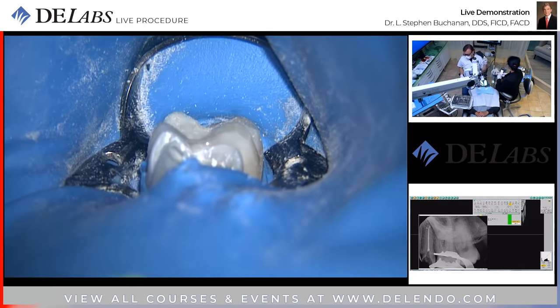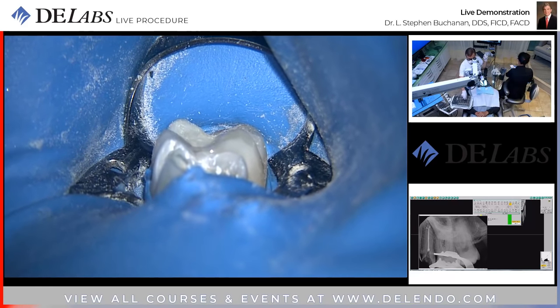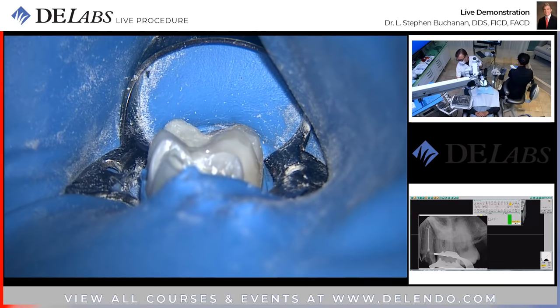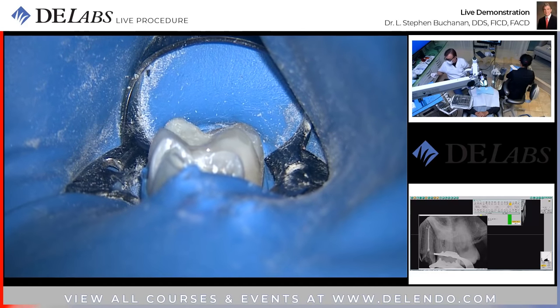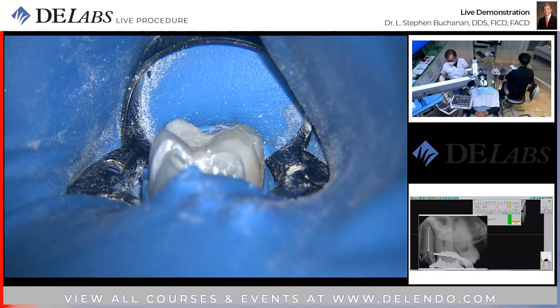Do I still look for tug back? Yes, I do. I want to have a cone fit just the same as usual, but now I've had to learn how to cone fit smaller cones because I'm cutting smaller shapes.